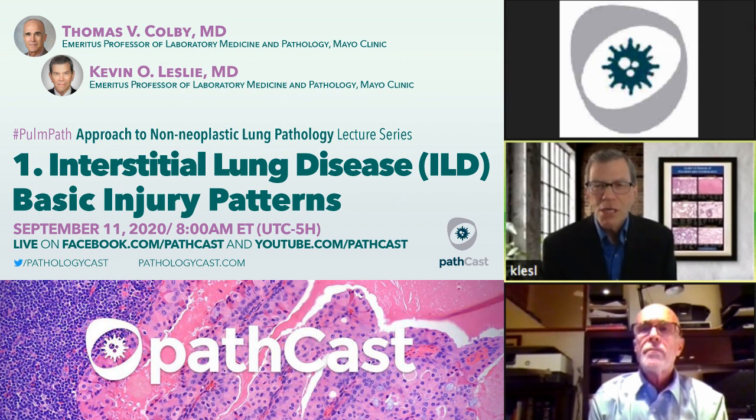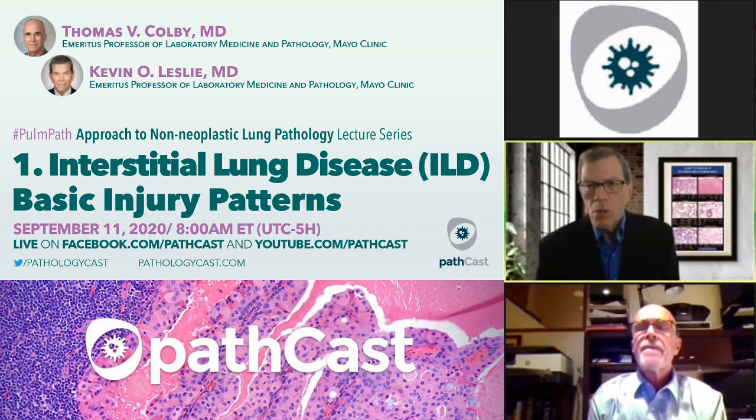That's an excellent question. So remember the mantra: acute injury is the one ring that rules them all. My tendency is to always, in any biopsy, focus first on the acute injury, and then talk about other features in the biopsy, because the acute injury is going to dominate every aspect of that patient's care for the present time. So focus first on the acute and try to get an explanation for why the acute has happened.